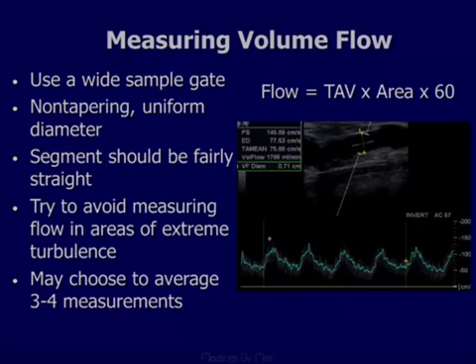Volume flow is something many folks have not done. That was one of the first things I did, but up in Albany we were interested in a lot of flow rates through our in situ bypasses, so that's how I learned how to do volume flow. Basically, the flow through any tube is determined by multiplying the average velocity through that tube by the area, and we get our volume flow.